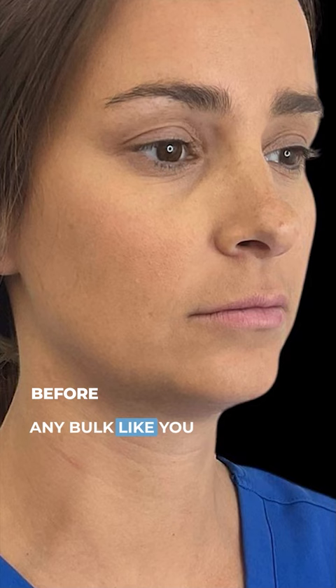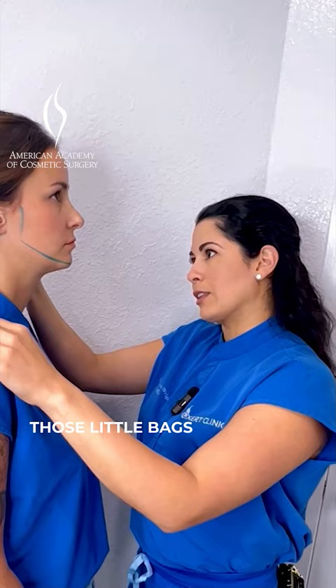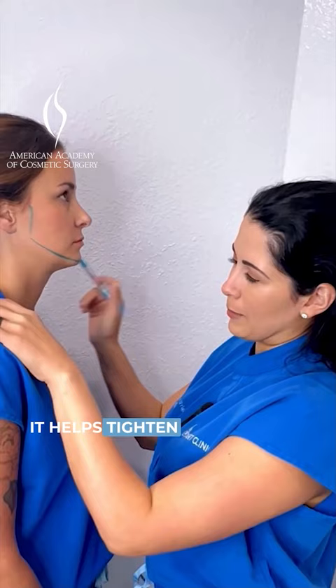If you're noticing that you're developing those little bags right here, I actually run the Renuvion skin tightening handpiece up until about the corner of the mouth, so it helps tighten up that entire area.